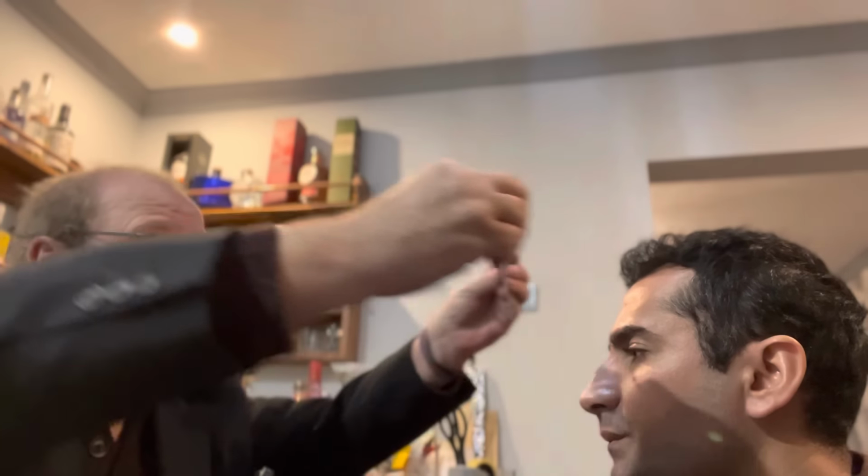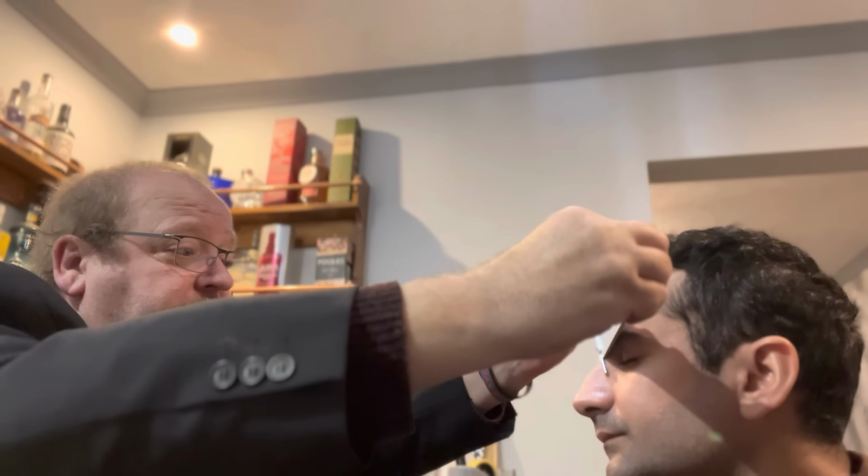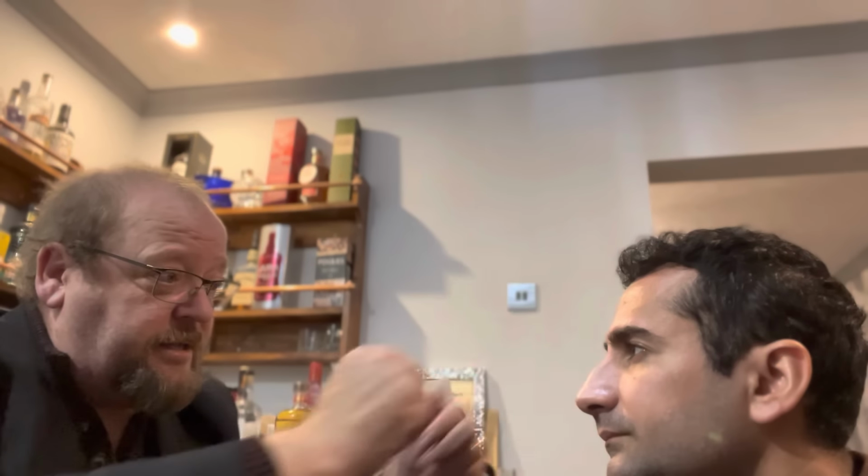And flick it round. And I do the same again, but from the left side. So again, I put the nought on top of your nose. And I bring that round. And that is more like 25. So as we look at your nose, we can see that it does look slightly different. If you look towards the camera, you'll see the nose is slightly wider at this point than there. Hence the reason everybody is different, so we need it done differently for that reason.